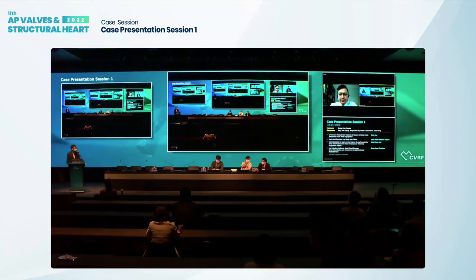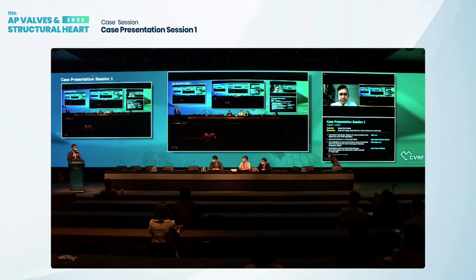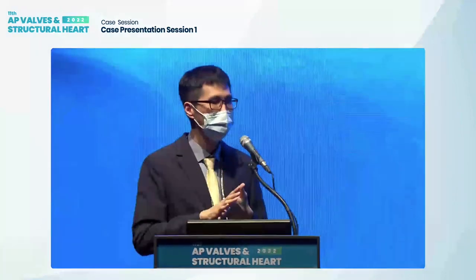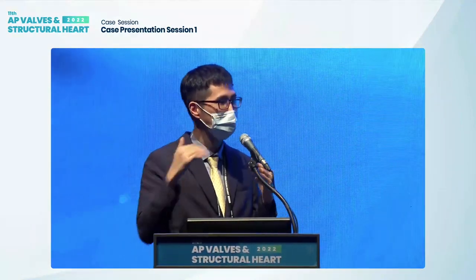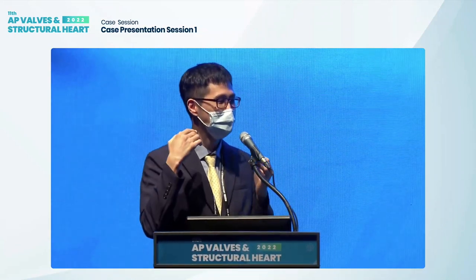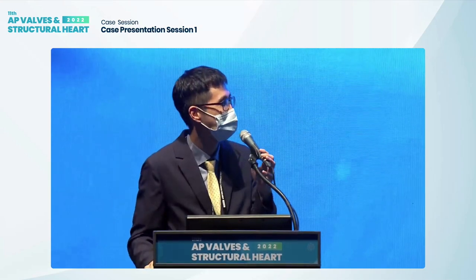And I have another question, because who did the balloon inflation? It's me. Did you feel any feeling of resistance? No resistance, but in that case, all our focus was on height. Very high implantation, a slow implantation, and all focus was on the valve device height. We didn't know about the rupture. Later, reviewing the imaging, we could check the rupture site.